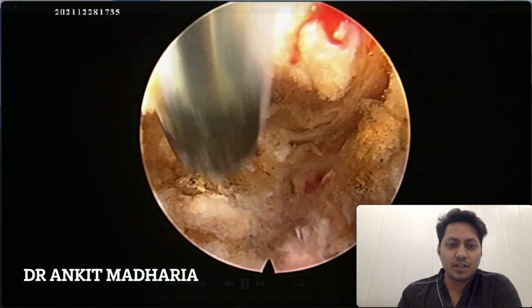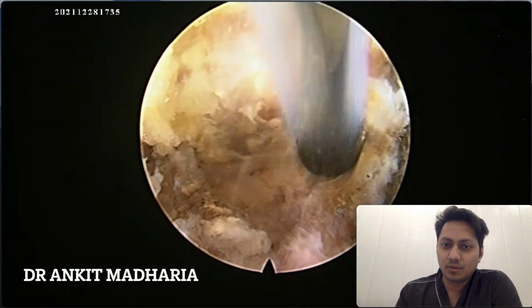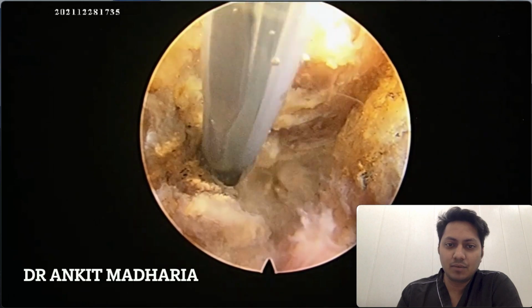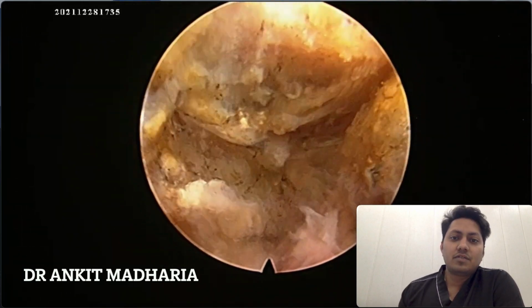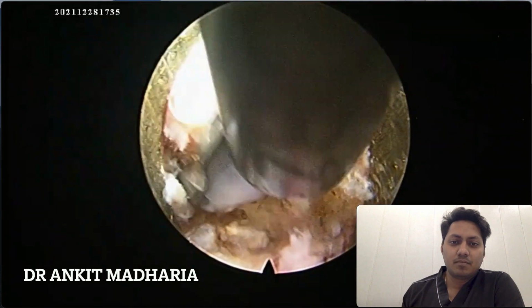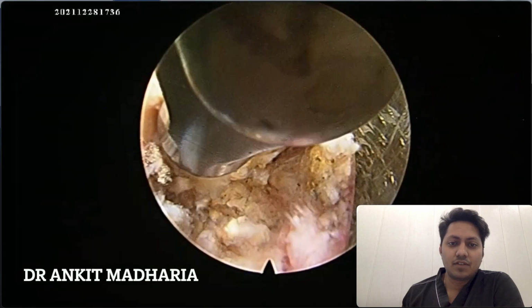Now this video has been fast forwarded at 200% speed, so things I am doing have been sped up here. Always we need to maintain hemostasis, so that our vision is always clear.